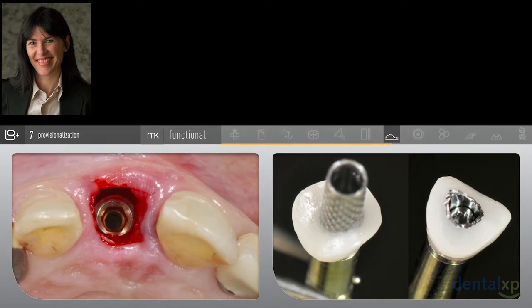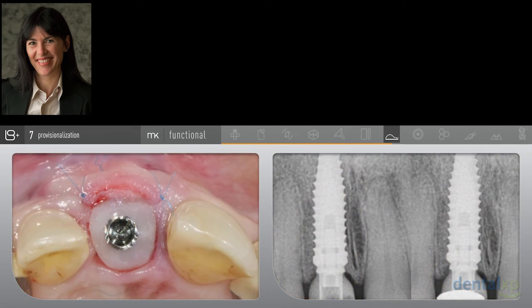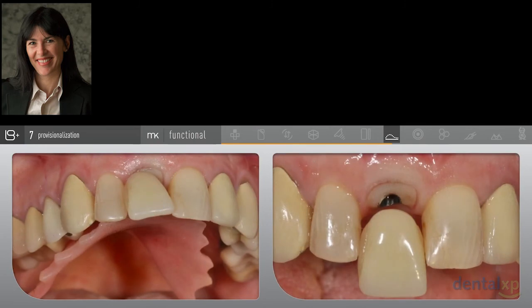So post-extraction, first thing I look at is that papilla is slumping into the extraction site. So I take some kind of transitional temporary abutment, whether it's a titanium or a PEEK style material. I customize it intraorally with a composite material. Here I'm tunneling a graft onto the facial, and my goal is simply don't lose the tissue architecture. Maintain its contour.